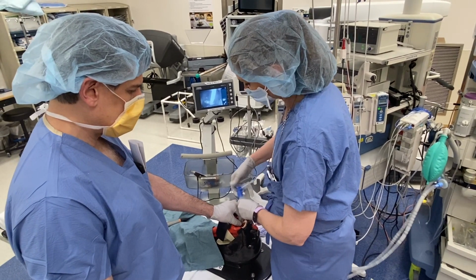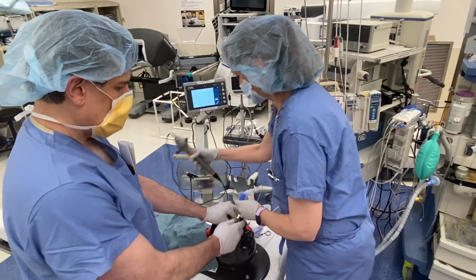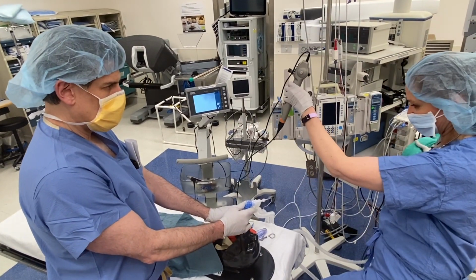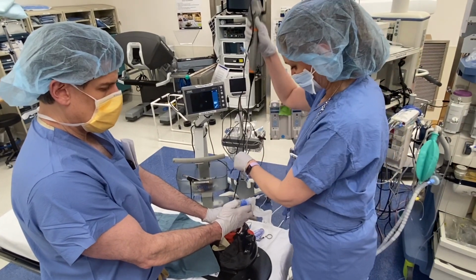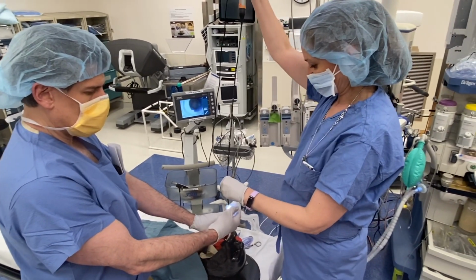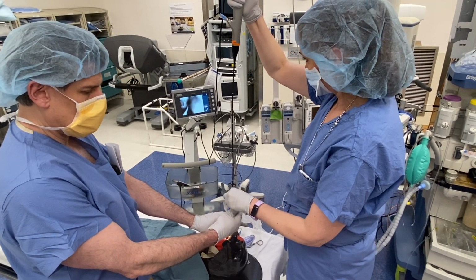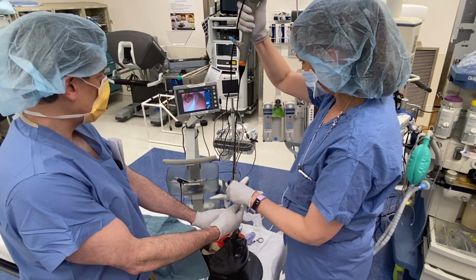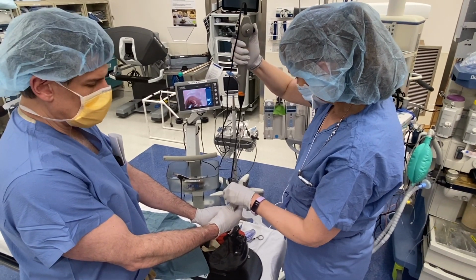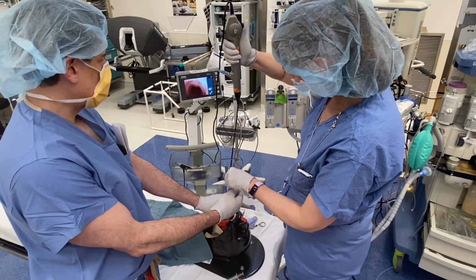We're now going to hook up back to the ventilator. You would reassess your ability to ventilate in case something has happened. And then the other thing you now can do is check the position of the tip of your ET tube using your fiber optic scope or your high definition video bronchoscope. As you can see is what we're doing now. You can also at this point use ultrasound if you want to instead of fiber optic or auscultation.